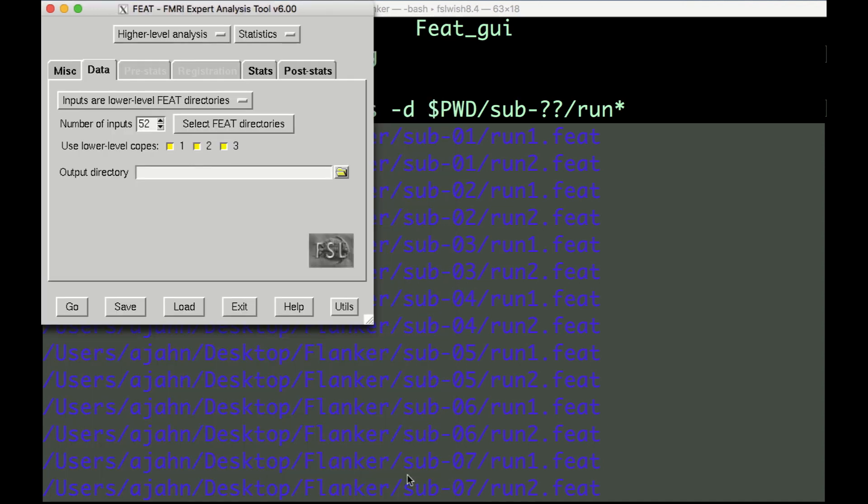When it's finished, in the Data tab, you will see that there are now three lower-level COPs that you can choose to analyze.